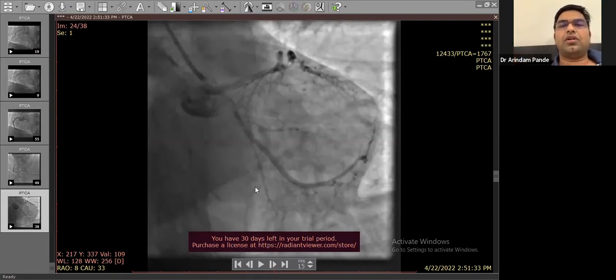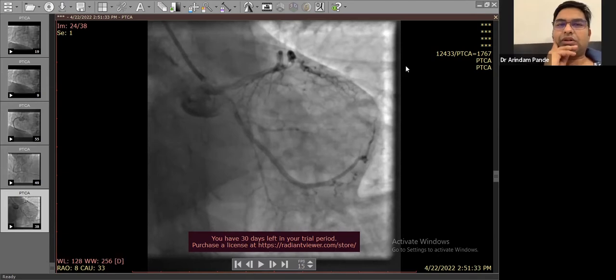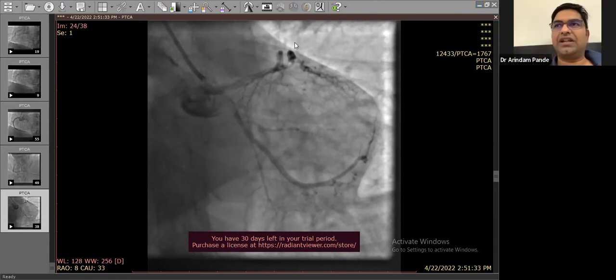So, did you find it? Exactly what position were your wire and balloon in? Do you have any picture of that? Yeah, we have the picture of the dislodged tip. Actually, when we took out the entire system, the dislodged tip was just inside the catheter tip. I can show you the picture. And then your wire, was it through the dislodged segment or at the side?